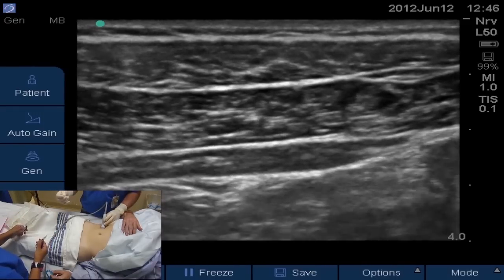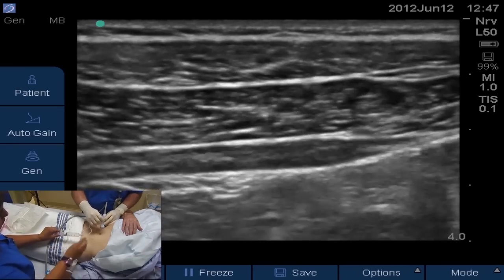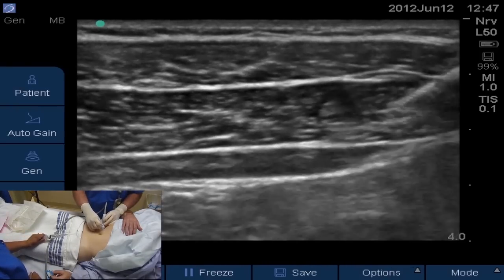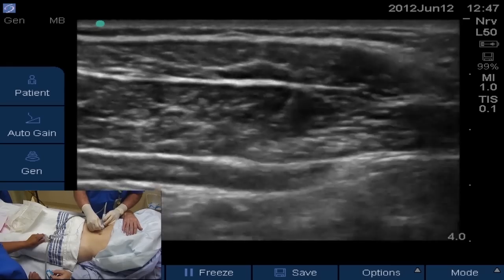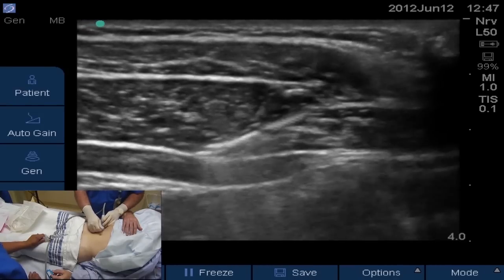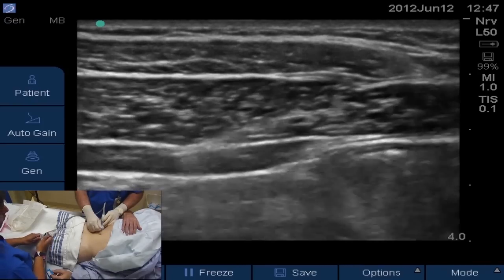We're going to get our Sonoplex needle and bring it in with an in-plane approach, coming from the right side of the screen going left, then take it down and try to open up the plane between the fascial layer of the internal oblique and the transversus abdominis muscle. You can see the needle coming in. The last two centimeters have echogenic properties that make it very easy to see when coming in at an angle. We're approaching the TAP plane, trying to pop into that plane.